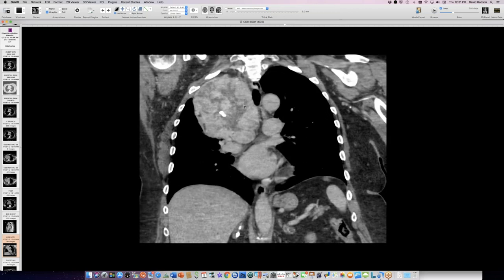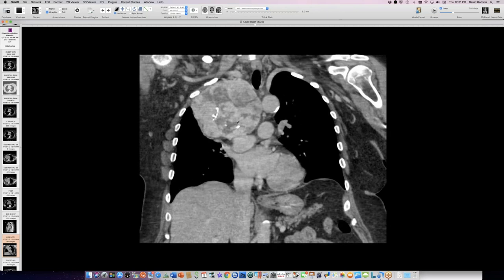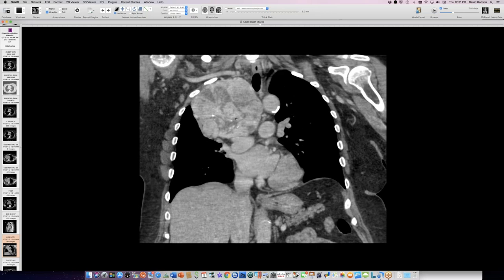And this is thyroid tissue with some nodular hyperplasia. So I think this qualifies, since it's not connected to the thyroid gland, as ectopic thyroid tissue. And if you want to say that there was nodular hyperplasia, you might say this is a kind of goiter. There was no malignancy associated with this, but they're calling it ectopic thyroid in the mediastinum here, away from the thyroid in the neck.